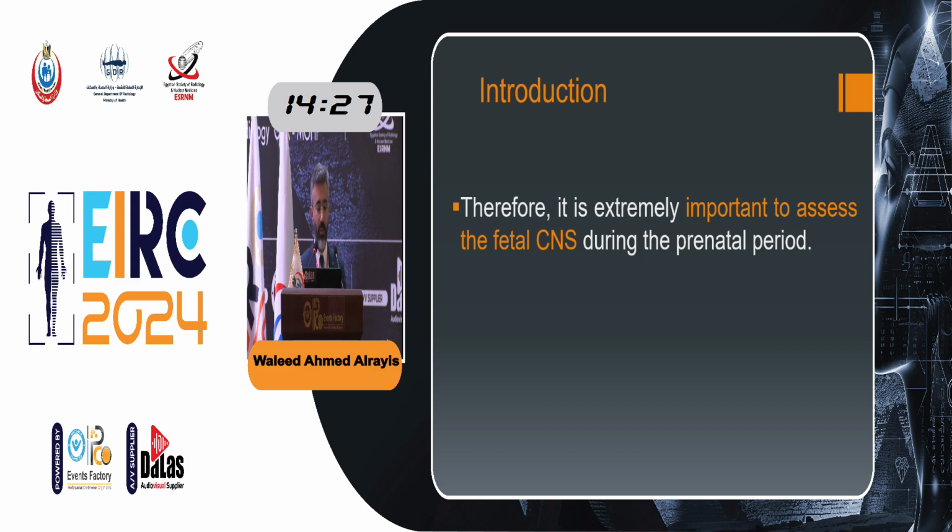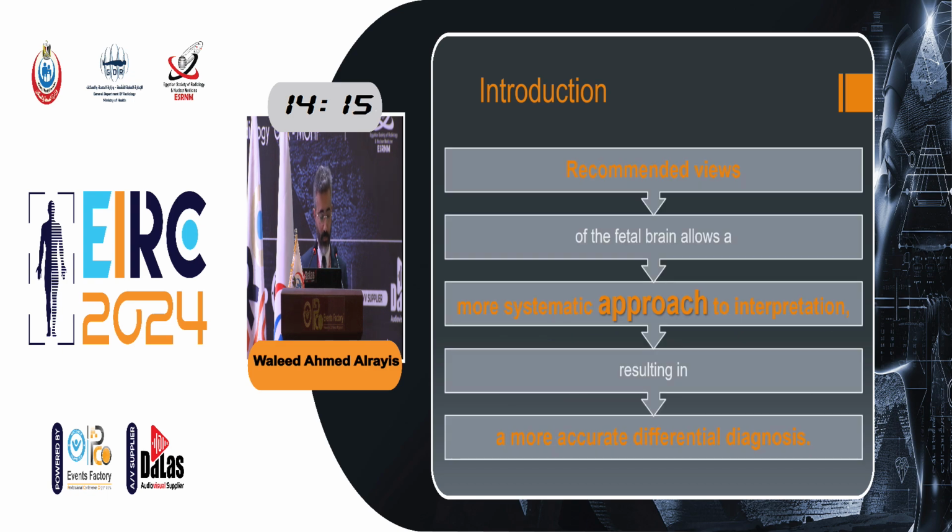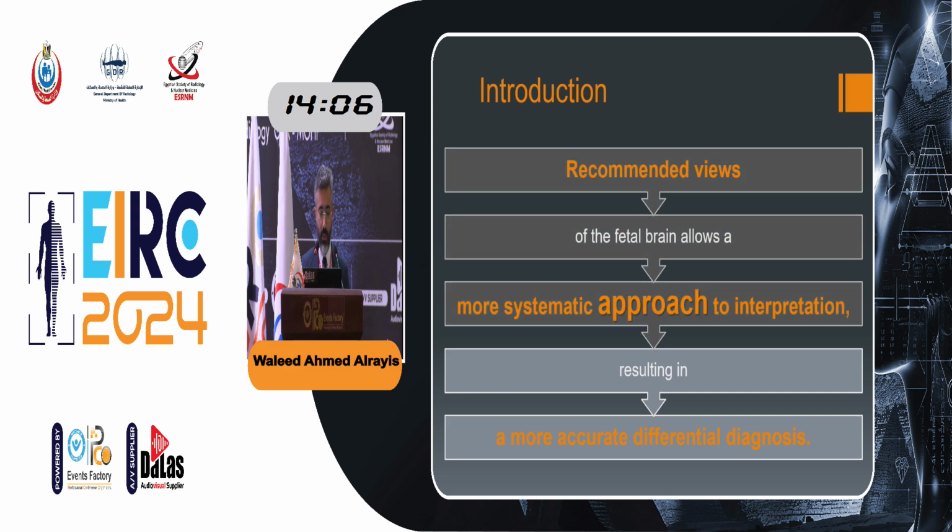Therefore, it's extremely important to assess the fetal CNS during the prenatal period. Every professional involved in fetal evaluation should be aware of the embryology and anatomy of the fetal CNS. In my presentation, I will discuss our recommended views of the fetal brain, which allow for a systematic approach in the interpretation to reach a more accurate differential diagnosis.